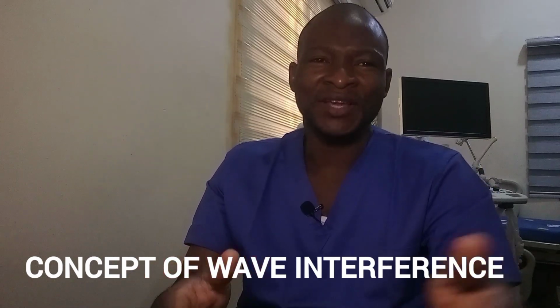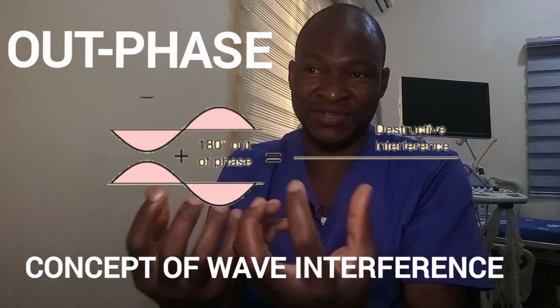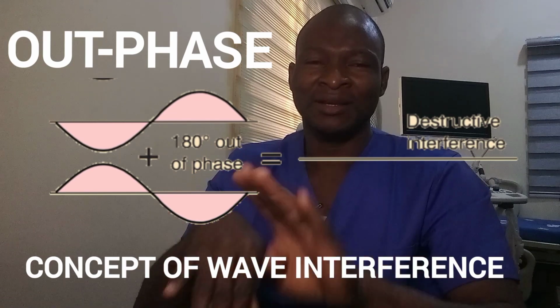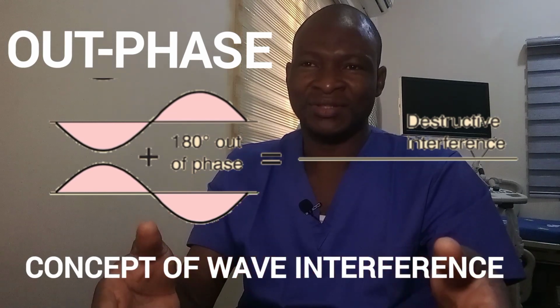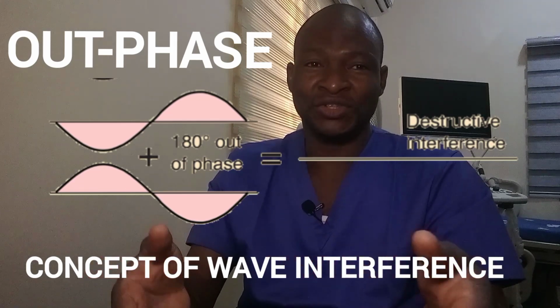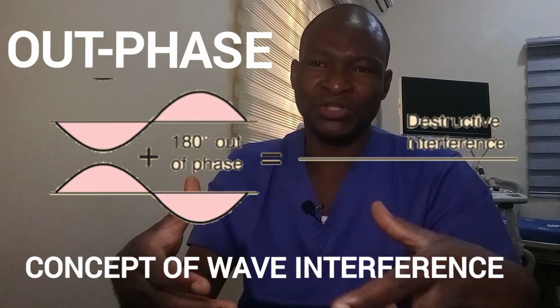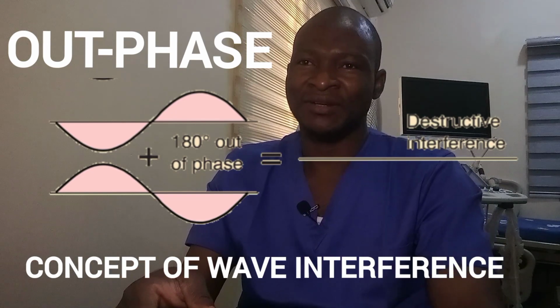Whereas in out of phase, if two waves superimpose out of phase, their peaks and valleys do not align. The result is a net loss of energy in the resultant wave. This type of negative superimposition is destructive wave interference.